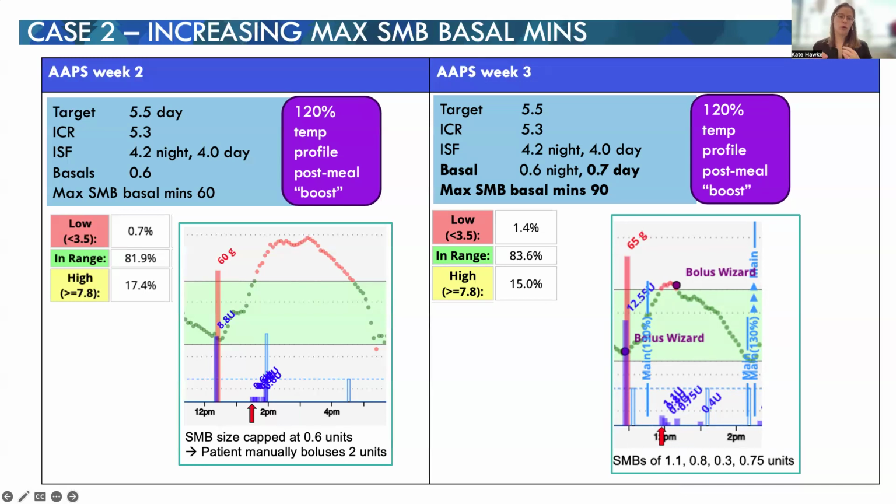And so while you're always going to be trying to optimize your carb ratio, your bolus time, this is an adjunctive strategy to help with rapid prandial rise. And if we can give more effective, more upfront, then we don't need to keep correcting those 0.6s as many times. And it may actually make our risk of late post-meal lows lesser as well, because we're not still doing corrections an hour after the meal.